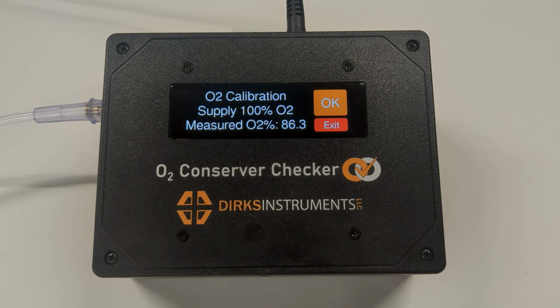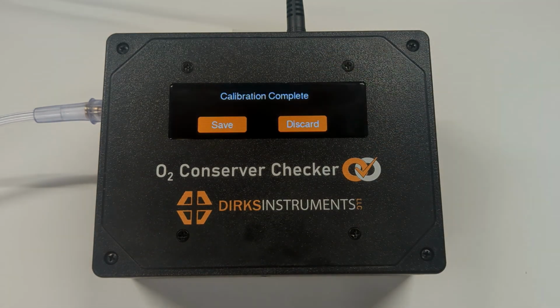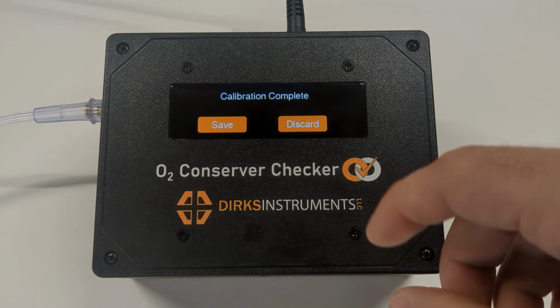Once that value has stabilized, you can select the OK button and this will set the value as the new oxygen calibration value. If you want to discard the calibration, you can do so by clicking Discard, or you can save it by clicking Save.